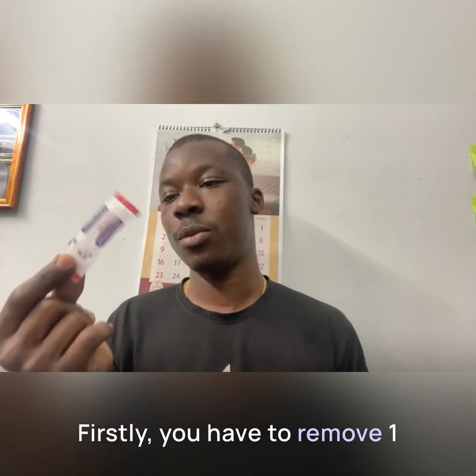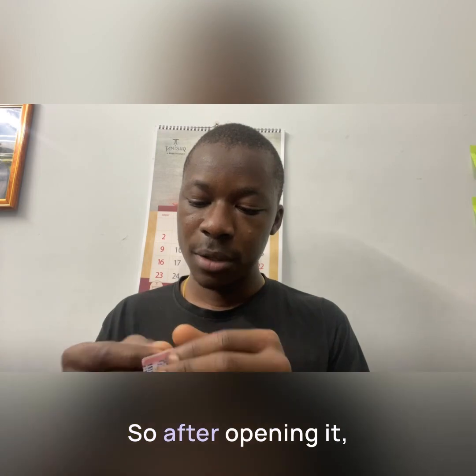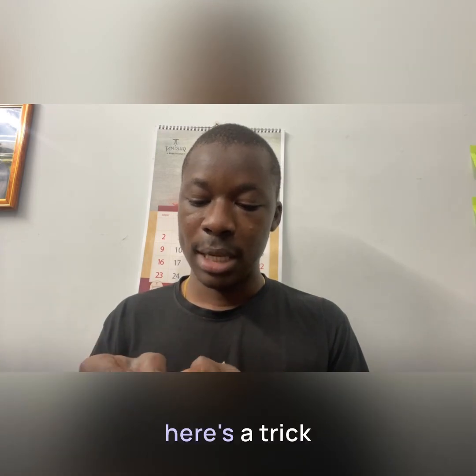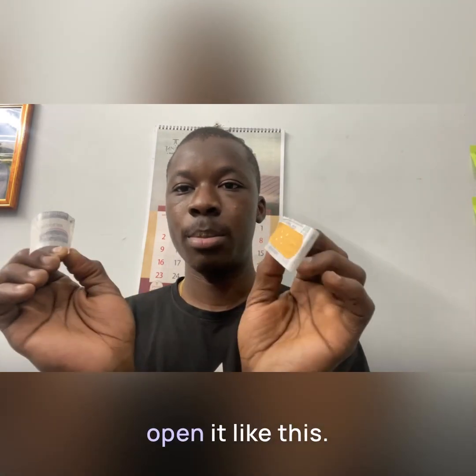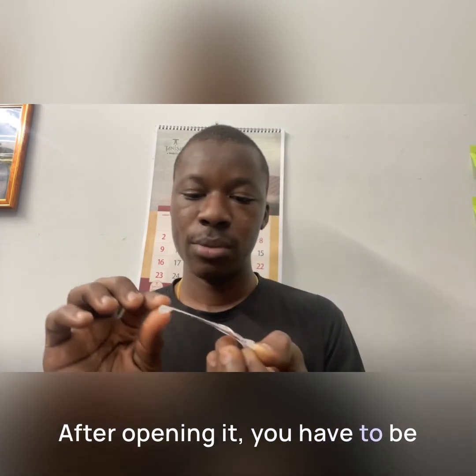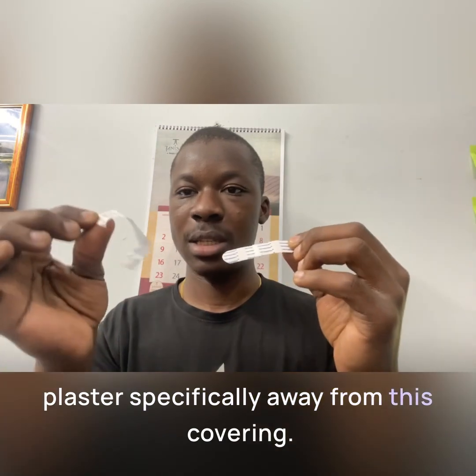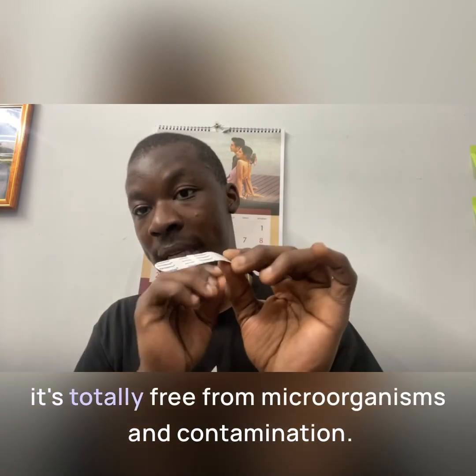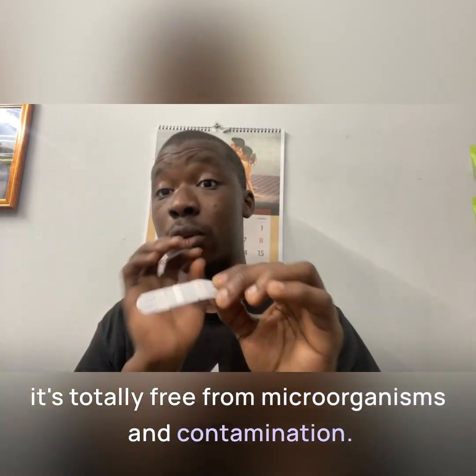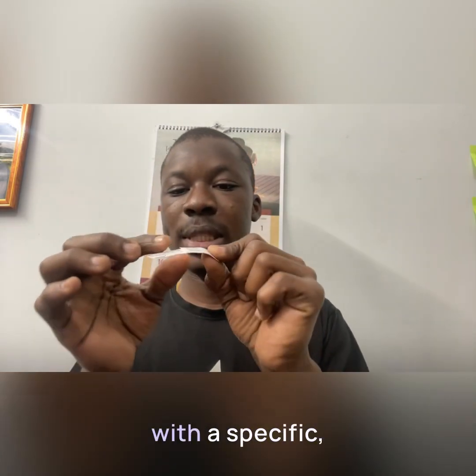If you say you don't know how to use it, I'm here today to teach you. Firstly, you have to remove the one that you want to use. You open it carefully. After opening it, here's the trick I want to share that you must take note of. Open it like this. After opening it, you have to be very careful when you remove this plaster away from this covering. You can see there are so many covers because they are trying to ensure it's totally free from microorganisms and contamination. This surface is also covered with a specific layer.